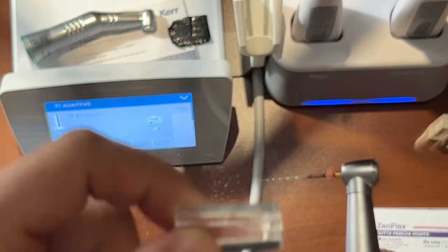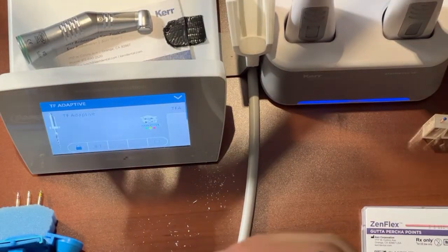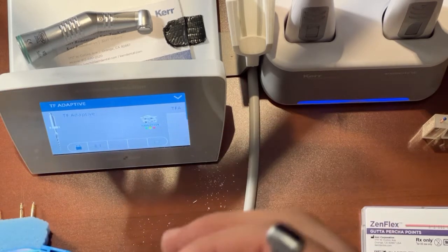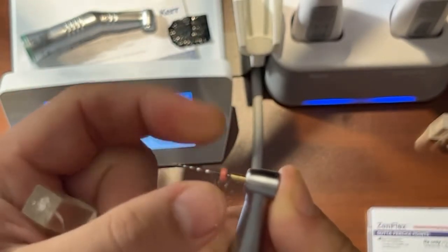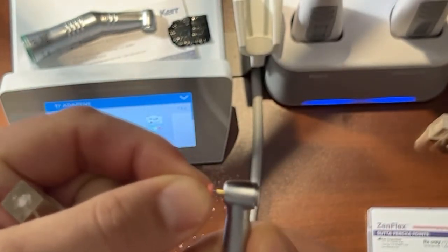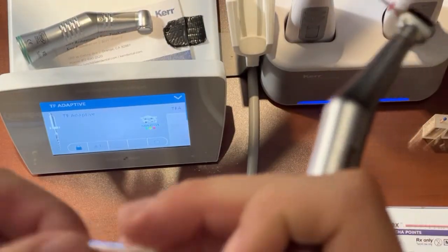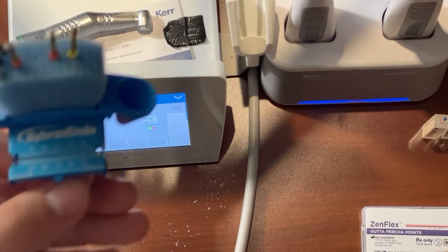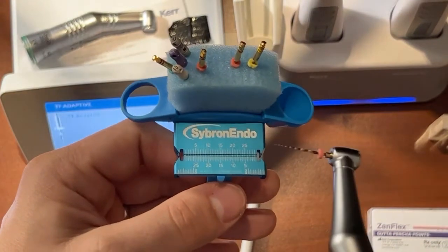Then, after we've created our glide path, we will go into our most likely last file, which is our shaping file. This is a 2506 ZenFlex file, and it should finish off the job for you. Another cool thing is we have our ENDO ring, which I can give to the office, no problem.